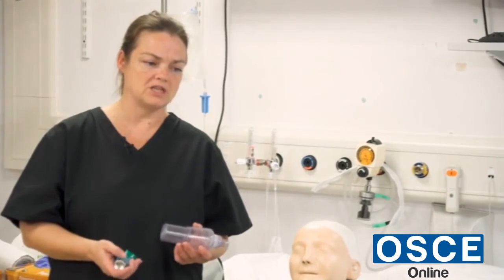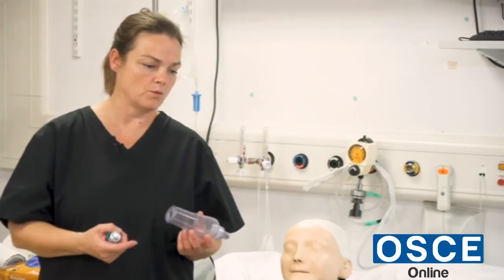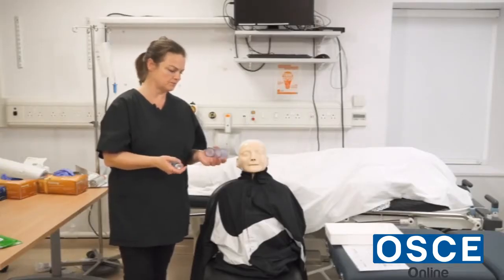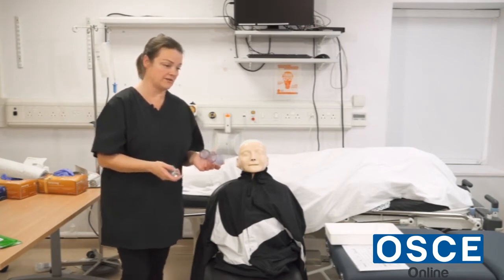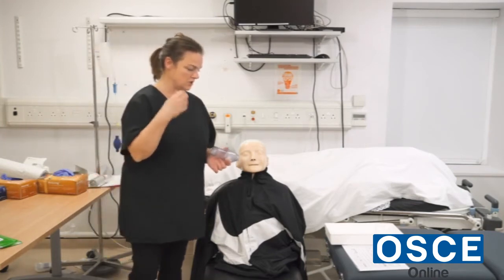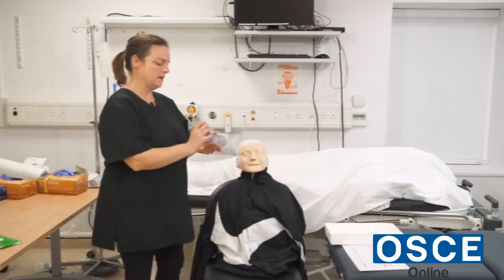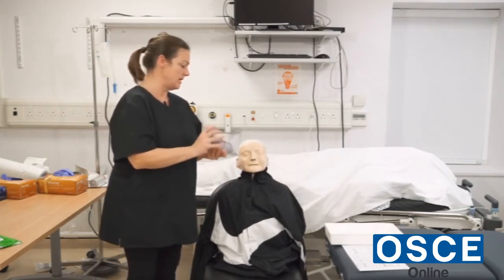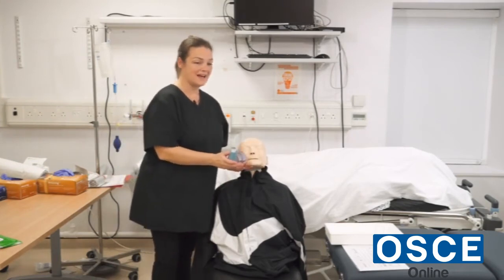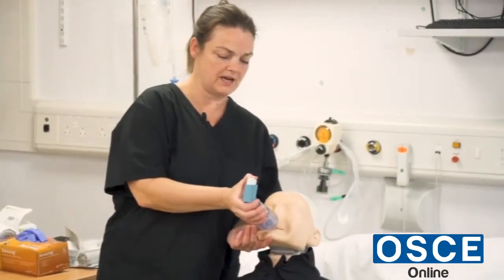If you feel you can't manage to hold your breath for 10 seconds, you can breathe in and out with the spacer. Which one do you think you'd prefer? To just hold your breath for 10 seconds, that's fine. Okay, so what I'm going to ask you to do is, first of all, I'm going to shake the inhaler, take the cap off, shake the inhaler, place it in the spacer device. I want you to tip your head back, shoulders back, tip your head back slightly, exhale, take the mouthpiece between your teeth and lips, and I'm going to give a measured dose.